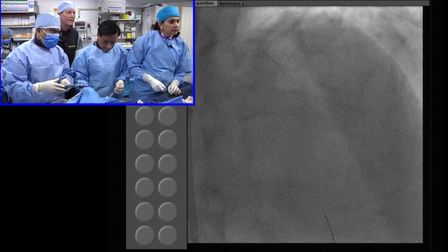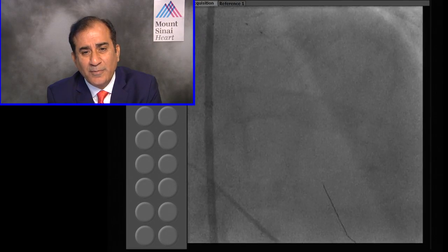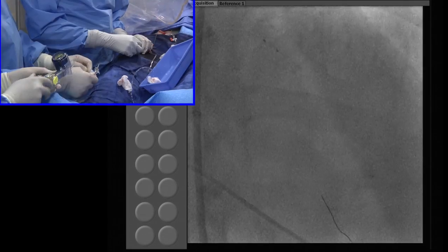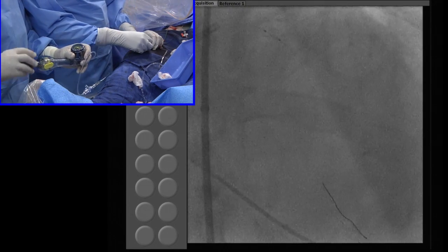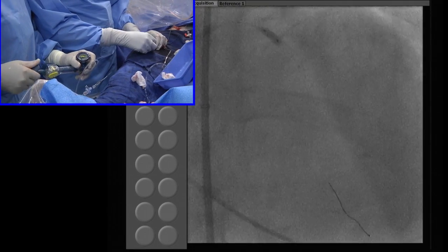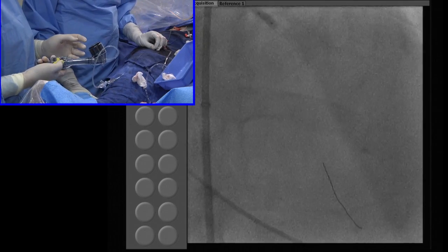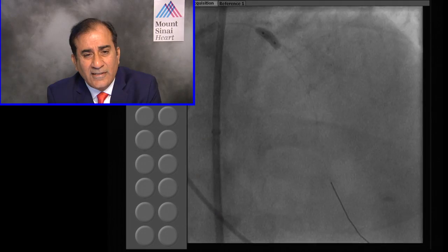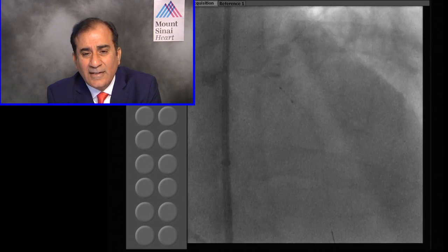I may recommend a little modification of that. I think it should be PSP with the appropriate imaging. You want to see proximally, and appropriate imaging would help in all three. Right, you're right. So maybe PSPI. Now, at 9:35, I'll proceed with getting the imaging for this.